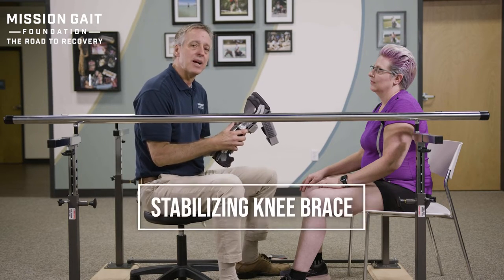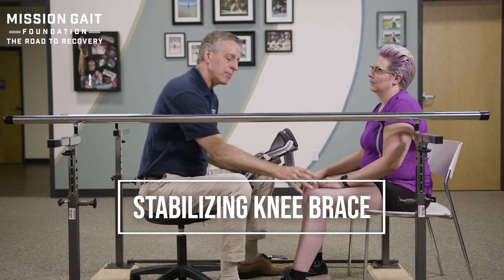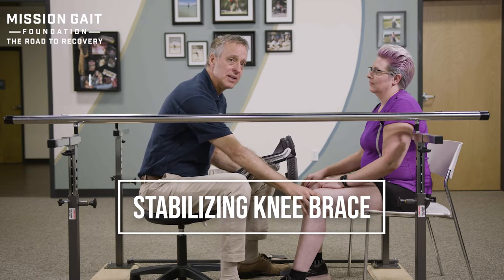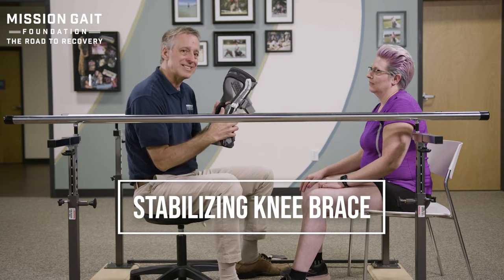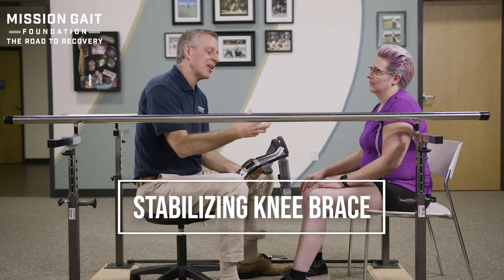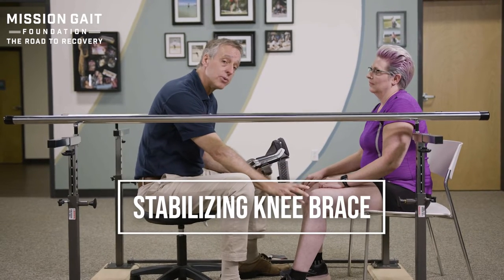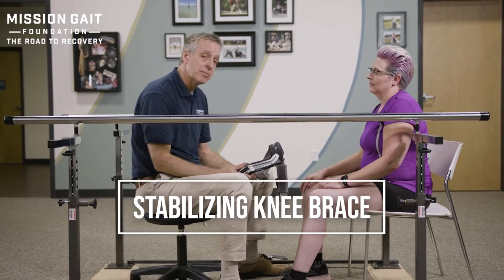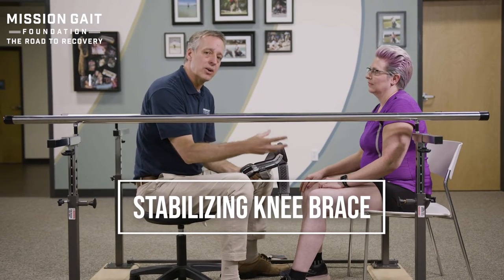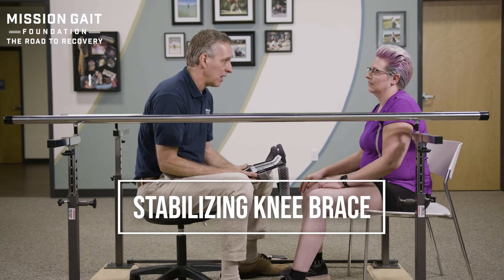On a knee brace, the idea is stabilization — trying to improve both alignment and stability of the knee joint. We have Sarah with us today and the brace that she utilizes. She has had multiple knee surgeries and has had knee instability over a long time period, so it wasn't just fitting her with a brace but an entire rehabilitation process of utilizing that brace as well.